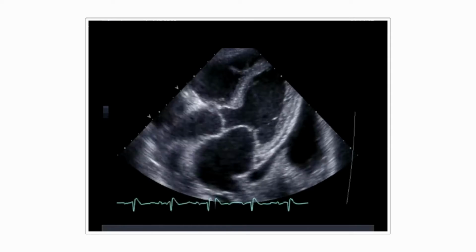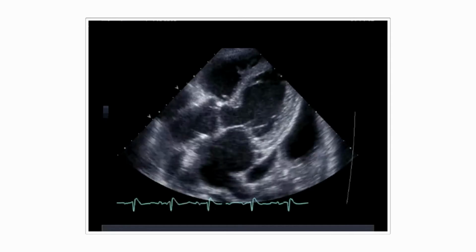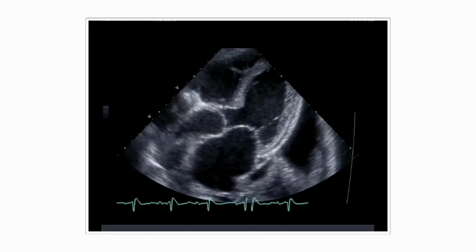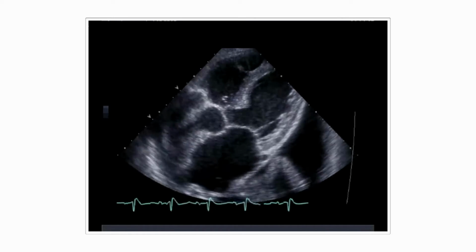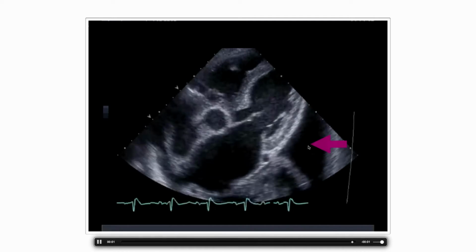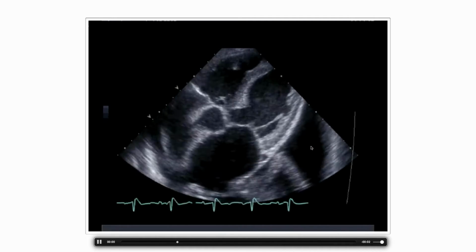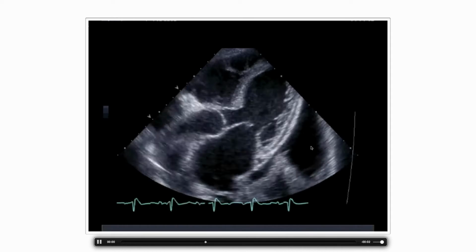And here, a very similar picture, only that is a patient that has a large anterior infarct. See also, he has a pleural effusion, you can see here, very nice. And it's a completely different picture than hypovolemia. Yeah, but not always, because here's an example of a patient who has very acute mitral regurgitation.